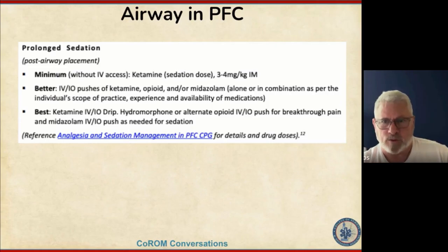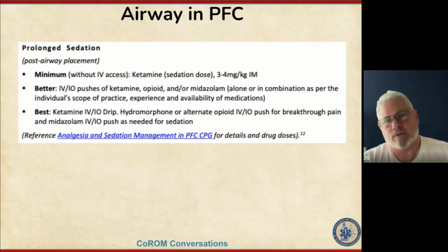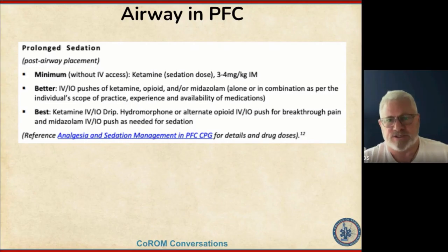If you're doing that with a normal 1,000 cc adult bag, you're going to give somewhere between 400 to 600 cc's of air each time you squeeze. Now it's worth taking that process and looking at it and maintaining it. Your pinky and your index finger are basically stabilizing the bag in your hand, right? You're not gorilla gripping the thing and squeezing it like it owes you money. You're just squeezing it every 5 to 6 seconds, giving 400 to 600 cc's each breath, and then that is adjusted based on the saturation of your patient and their end tidal CO2. This is a kind of a dance that you're doing for that prolonged bagging of a person.